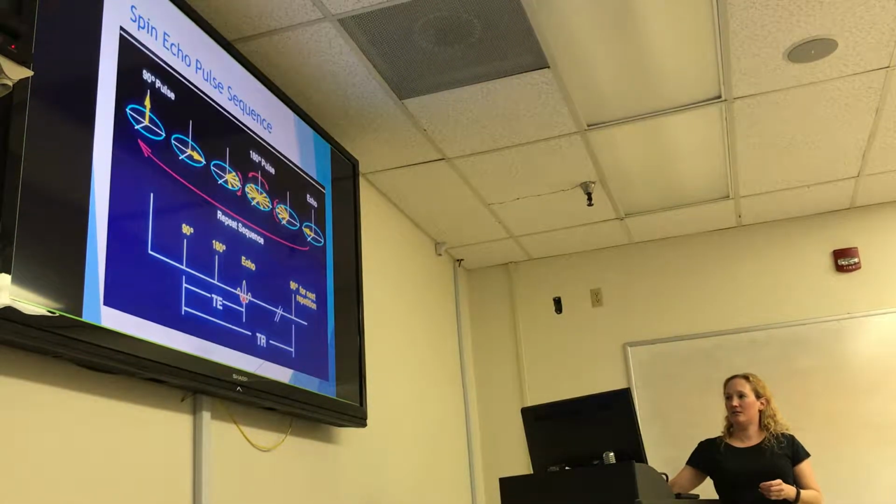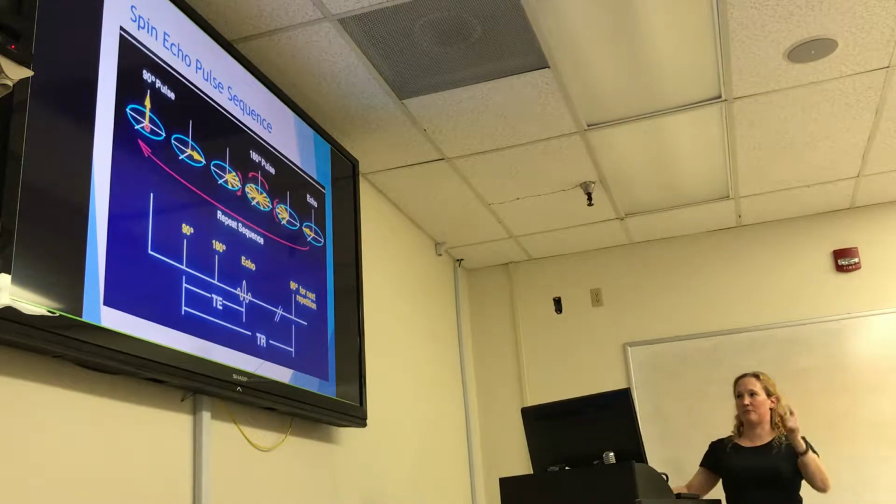All right, so here's a nice little diagram showing us basically laying out what happens when we run a spin echo sequence. Oh, I remember my other point.